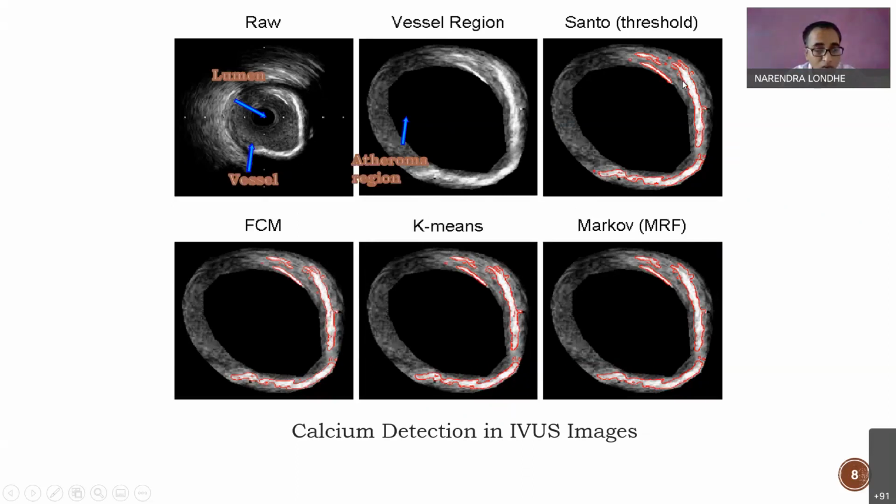wall. So whenever your blood vessels or arteries have this deposited calcium, if it increases, then it blocks the blood flow, and due to that you start to get either a stroke or a heart attack. All those things happen, and due to that sudden death of a human being occurs. So this was also a very challenging research where we tried to find out this calcium. We successfully found it, and we also measured the volume of that calcium.